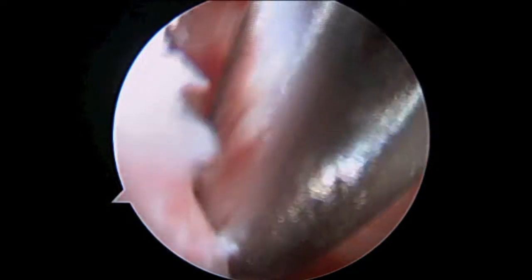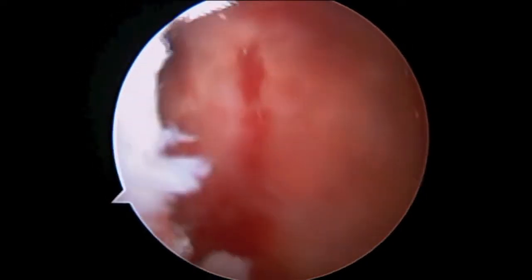Now we're cleaning off the front edge of the socket to assess how much bone has been lost, and also to determine the quality or stoutness of the labrum and ligamentous tissues.